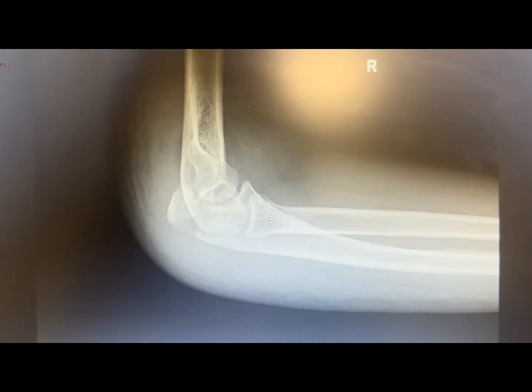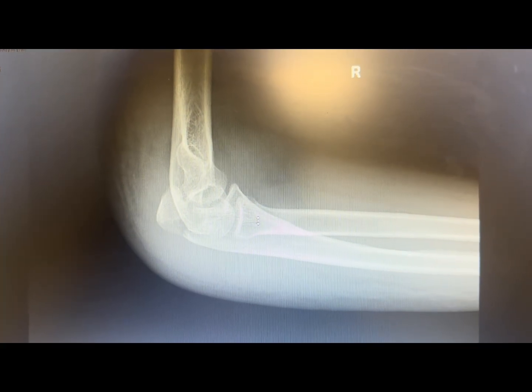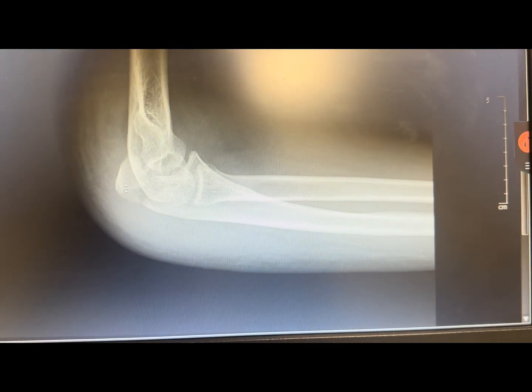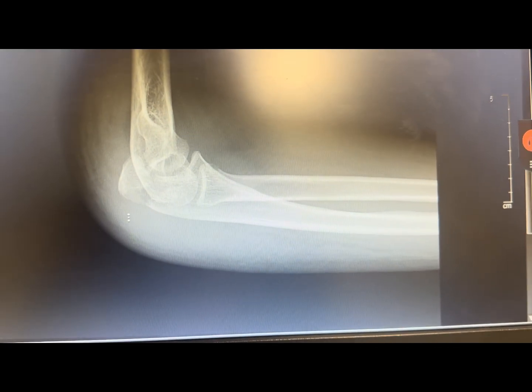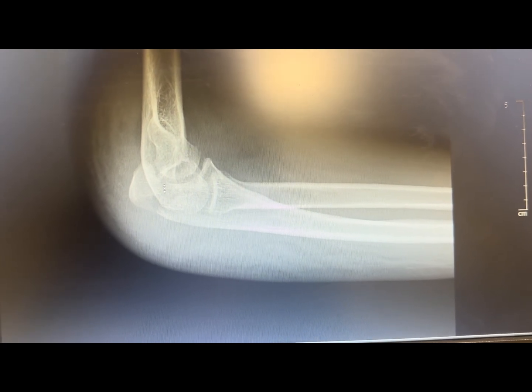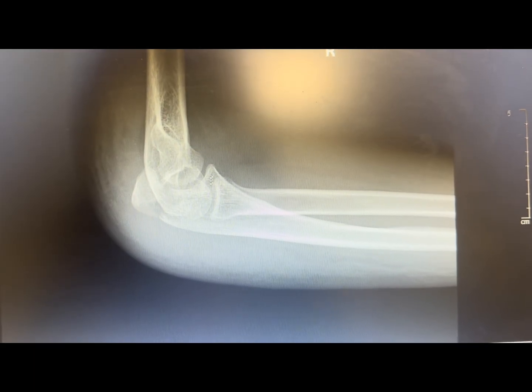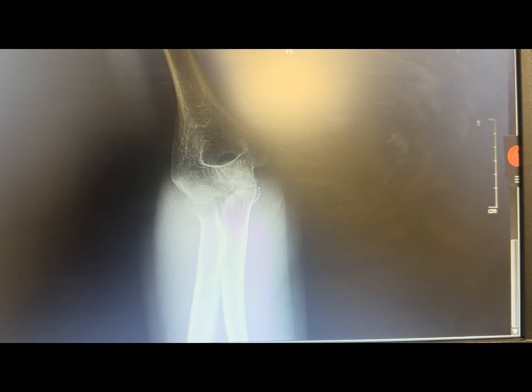Today we are going to do the tension band wiring of the olecranon fracture. This is the lateral X-ray of the right elbow. You can see this is a two-part fracture with another fragment here. There is displacement — it's a simple transverse fracture of the olecranon with a little bit of comminution of the anterior cortex, but most of the cortex is intact. That's why we are going for tension band wiring. If there is any comminution of the anterior cortex, it's better to go for plating. This is the AP X-ray of the olecranon fracture — there is not much displacement here.